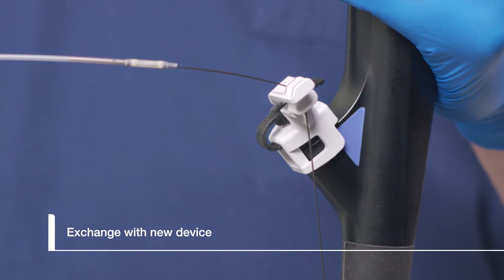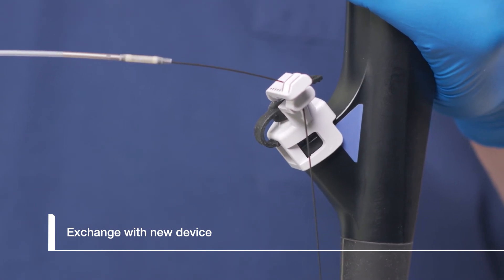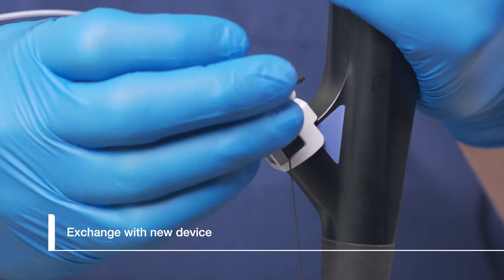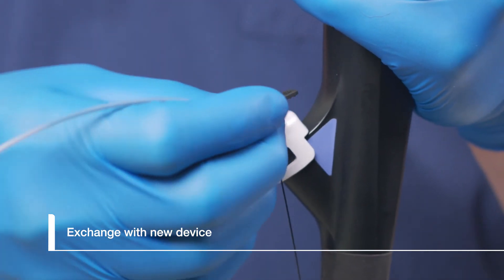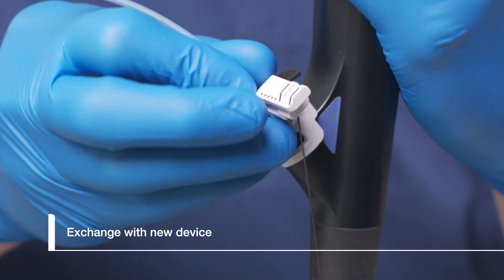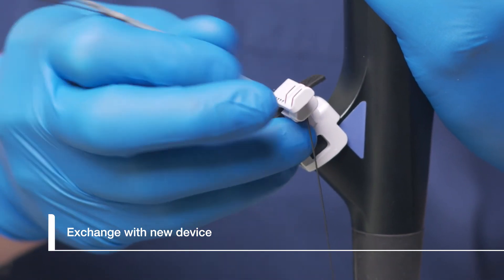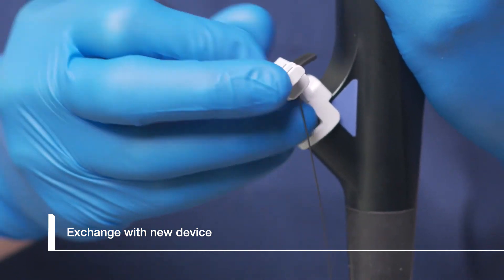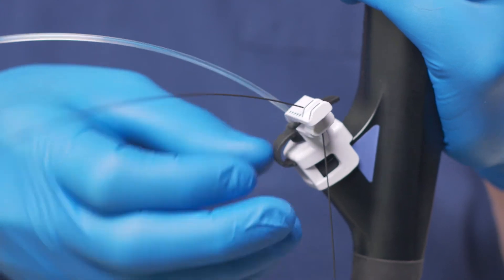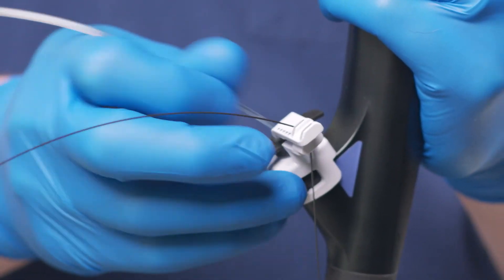Backload a new device, such as a distally wire guided extraction balloon, onto the appropriate guide wire. When the tip of the balloon reaches CleverLock, unlock the guide wire and advance the balloon into the biopsy cap. The elevator may be used to maintain guide wire access in the bile duct. Once the guide wire re-emerges from the balloon, it may be locked in CleverLock in one of the free slots.